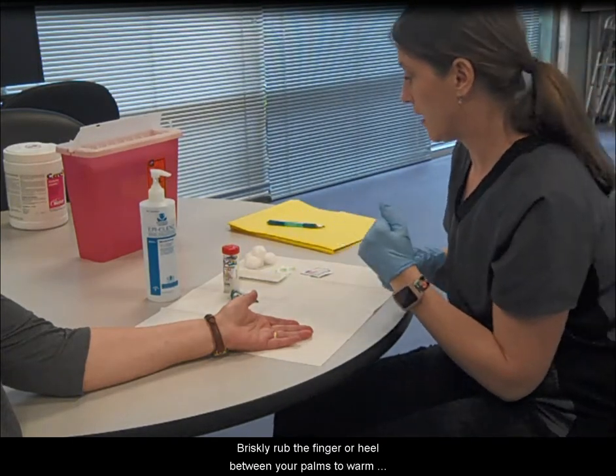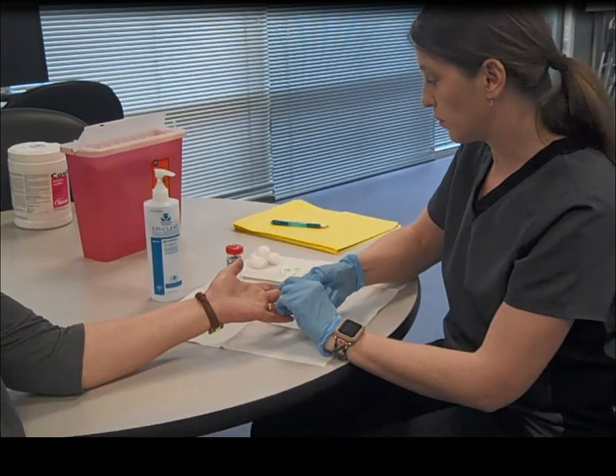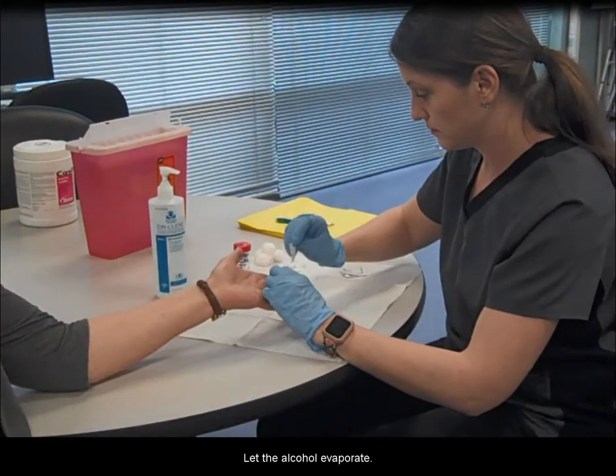Briskly rub the finger or heel between your palms to warm it up if it's cold. Wipe the site with alcohol and let the alcohol evaporate.